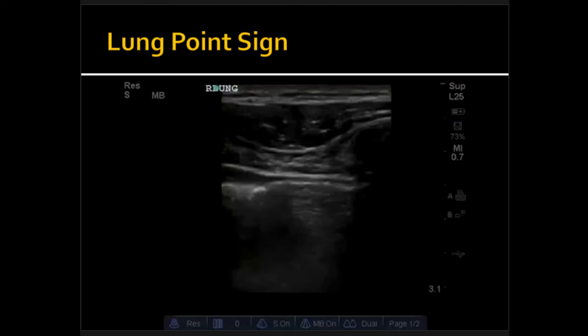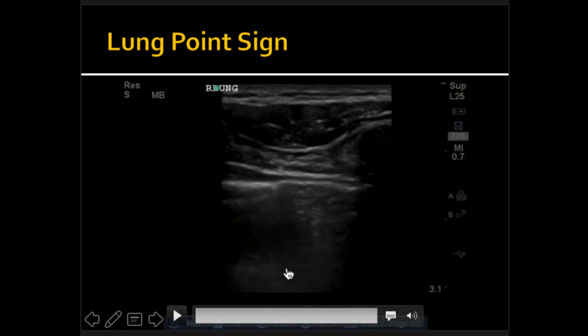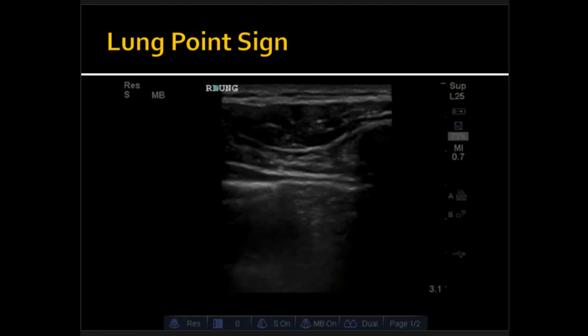If that's not convincing enough, you want to see the lung point, which on B-mode — the normal 2D mode — is the movement of pleural surfaces against a motionless pleura. Lung sliding transitioning to motionless pleura is 100% specific for pneumothorax. In M-mode, you'll see a sandy shore that turns into a barcode. Once you see that, that's pretty much diagnostic for pneumothorax.